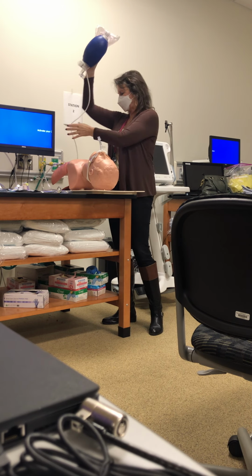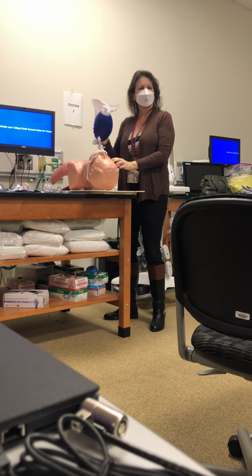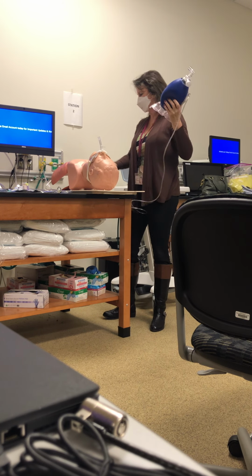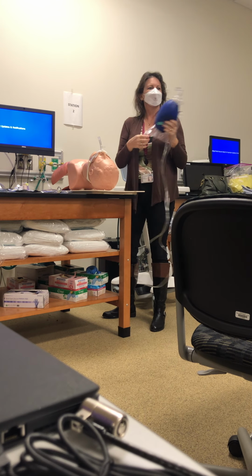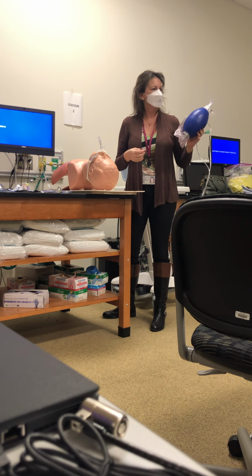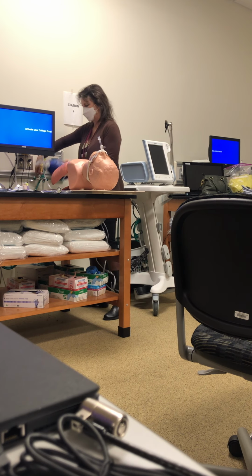I've got my ambu bag. So what do I need to do with my ambu bag? I'm going to take his non-rebreather off. What do I need to do with this? Okay, so I need to connect it. So I'm going to connect it.